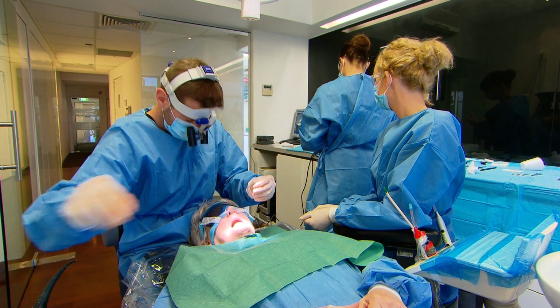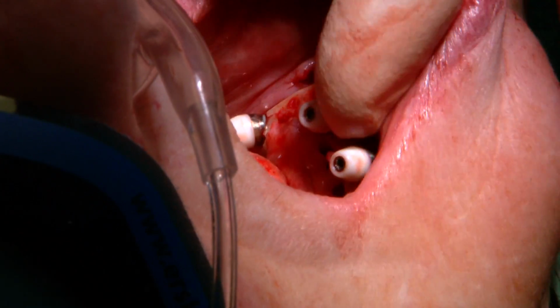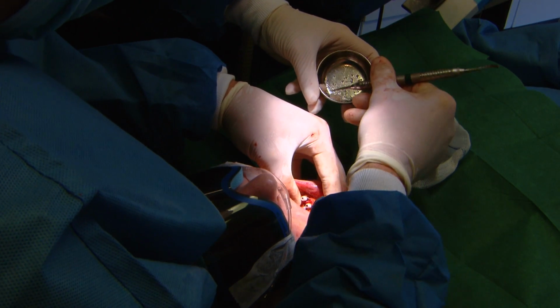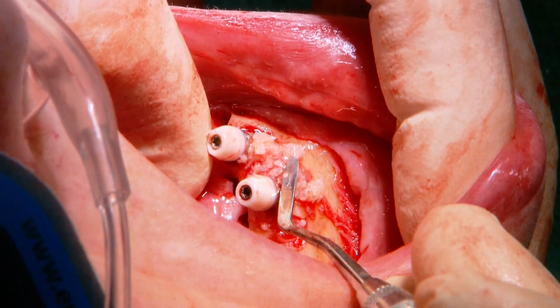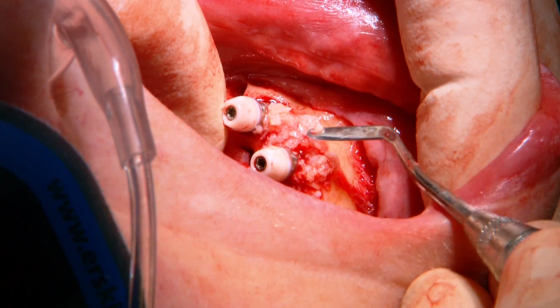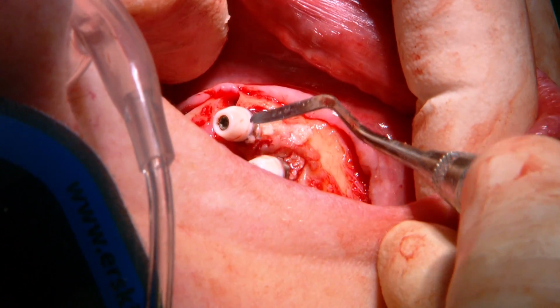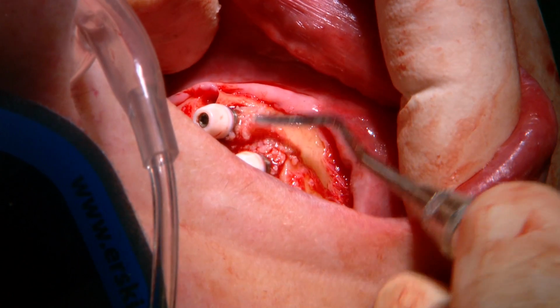Next thing we do is we put little protective caps on top of the abutments so we can do our stitches without them getting caught on the abutments. Remember the bone we collected before? We put that through a milling unit to make it nice and fine, and we use that to fill in all the deficits and defects that have been created by the removal of the teeth and placement of the implants.